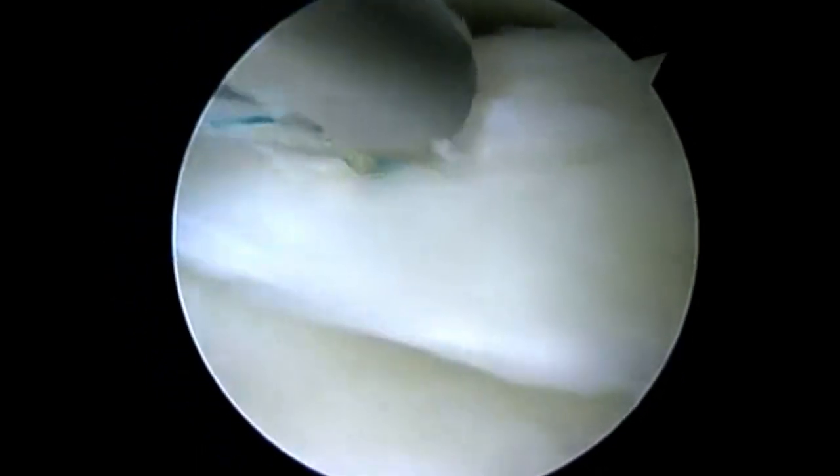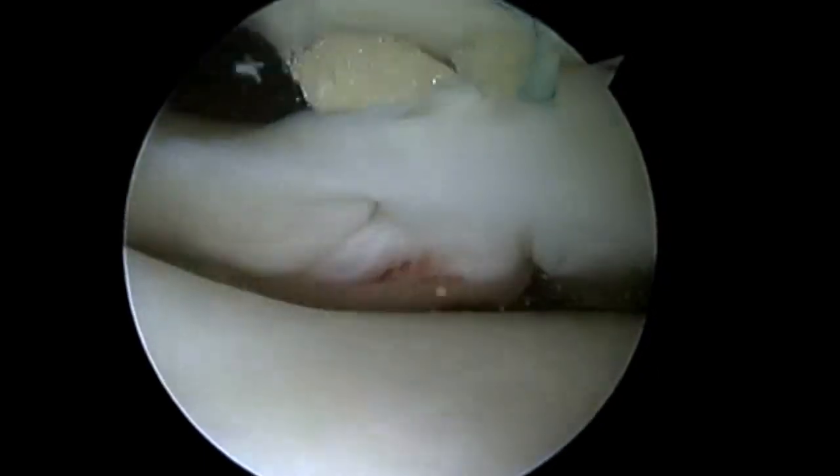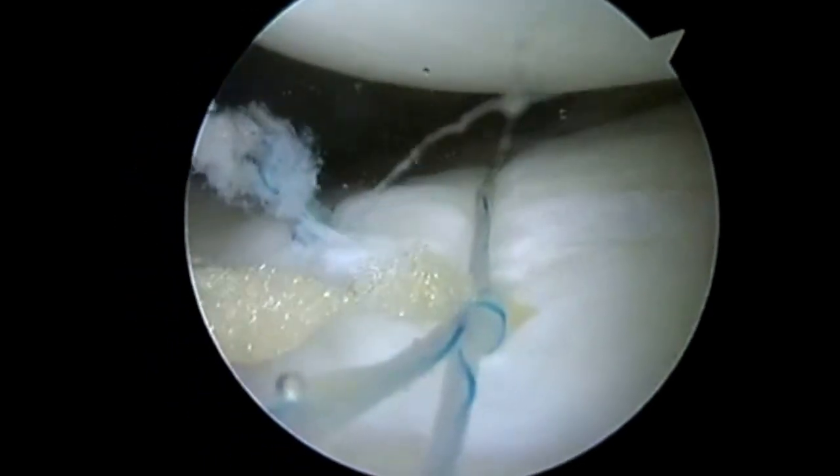After I've secured the knots, you can see that other vertical split I talked about here. We've got a nice repair posteriorly as we start moving anteriorly.